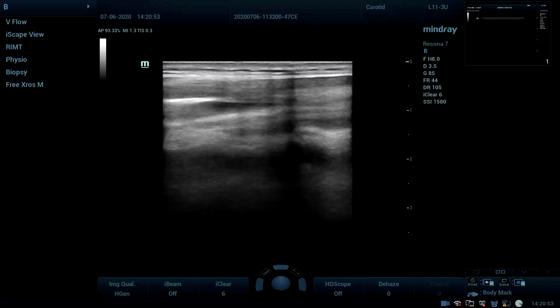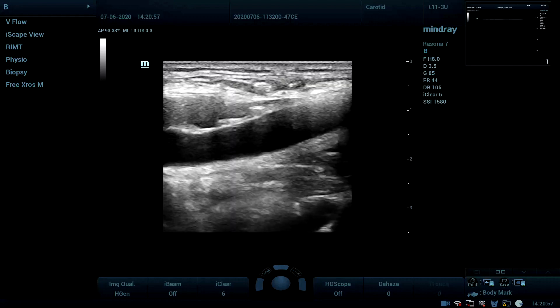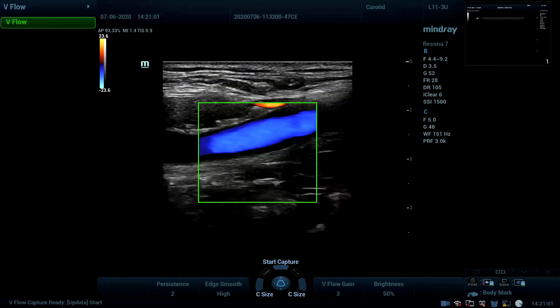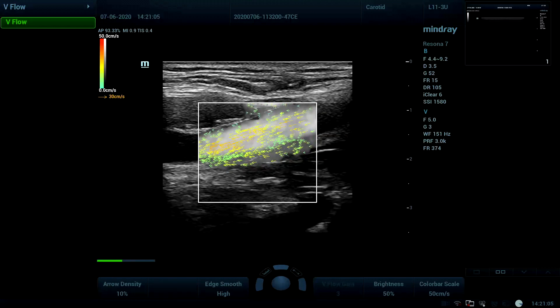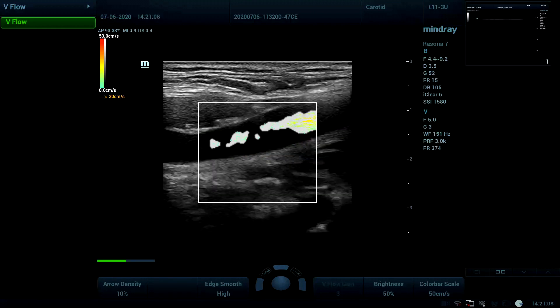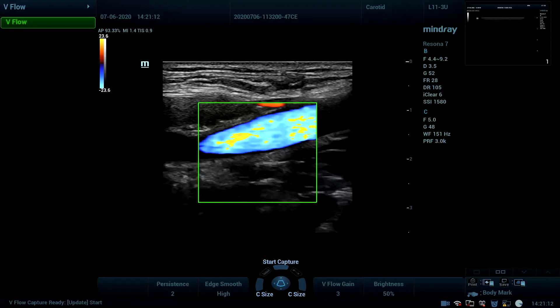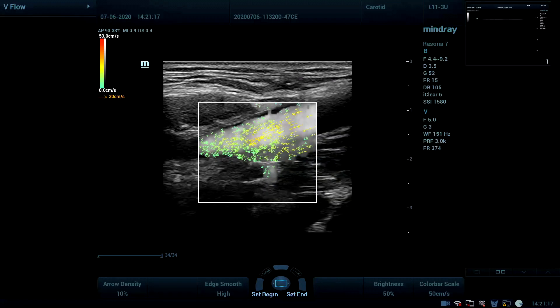Vector flow is a quantitative color coding of vectors or arrows that display both the velocity and direction of blood flow in the vessel. We have a high frame rate of up to 600 frames per second, and it is non-angle dependent.